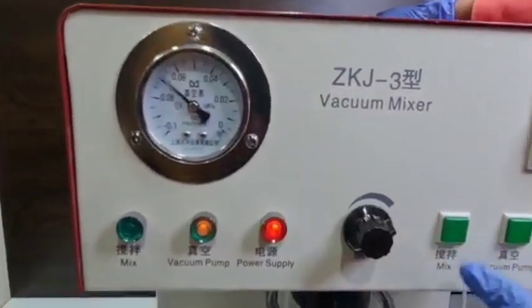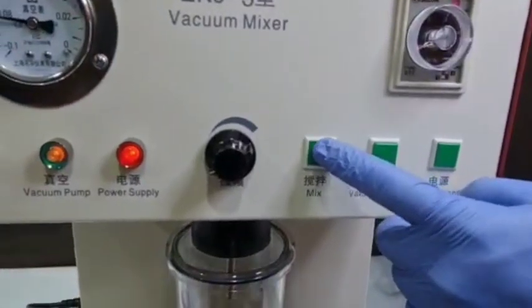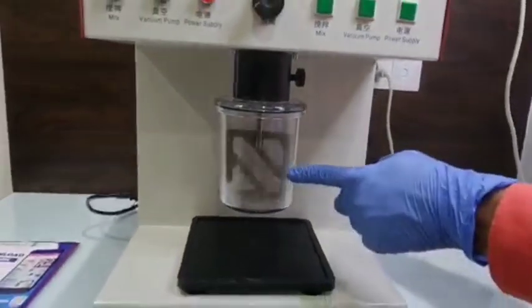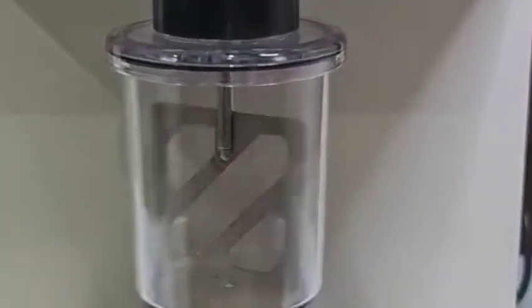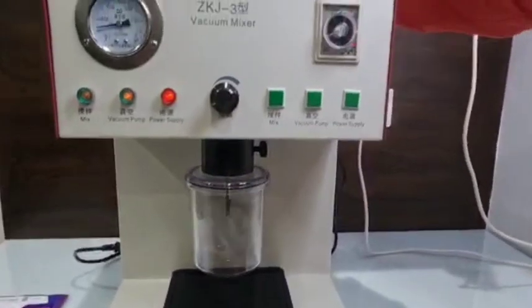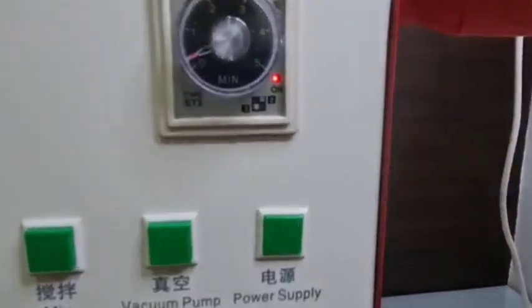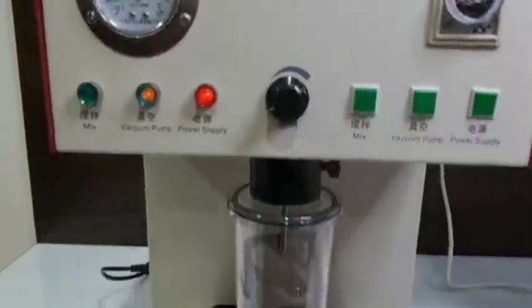Once, with the help of the vacuum, it is fixed, you will press the mix button. It will start to mix the compound — the investment material which is in it. The timer with which you have set, it is going to work according to that. See how it is working.